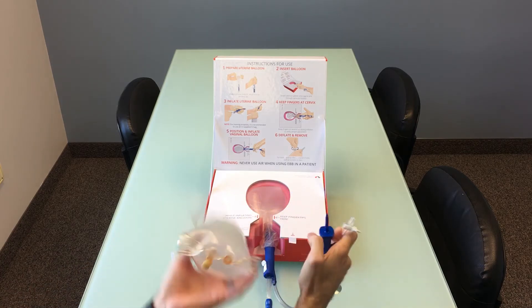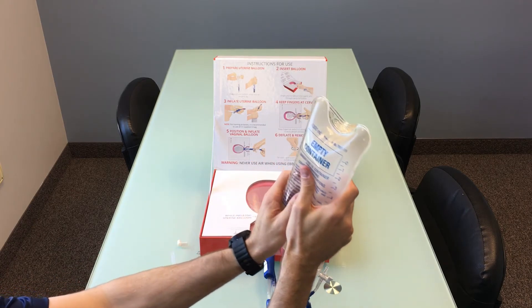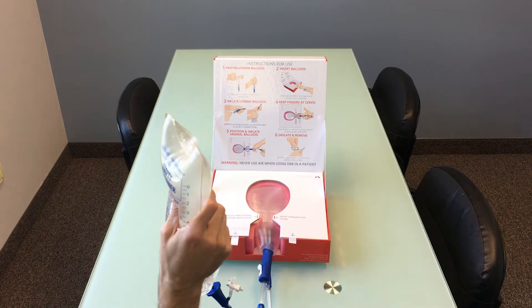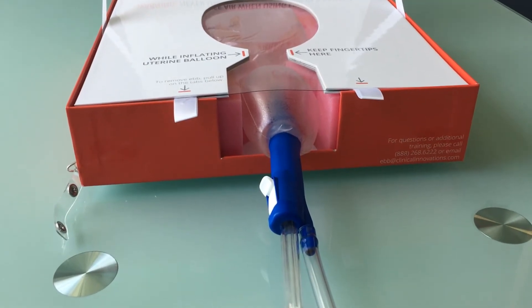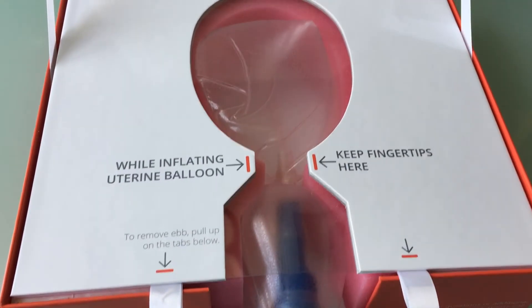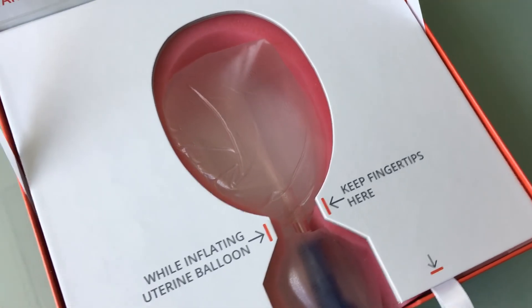Again, do not be alarmed about the bagpipe noise, as this will not happen when fluid is used. The PPH trainer box gives a great representation of how the uterine and vaginal balloons work together to anchor and keep the balloon in place tightly from both sides of the cervix.